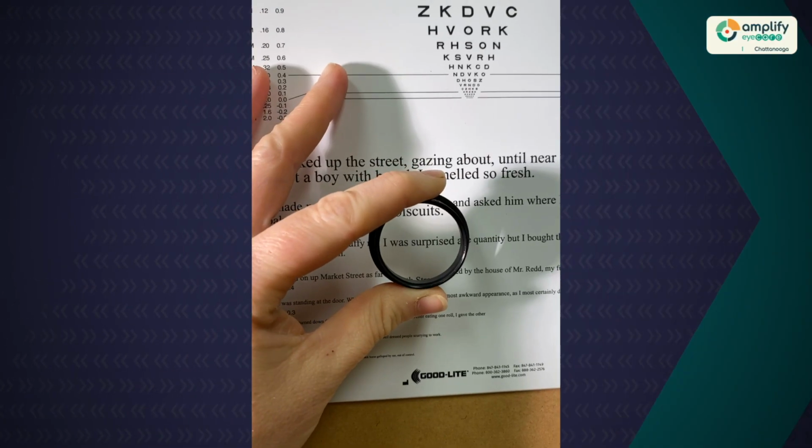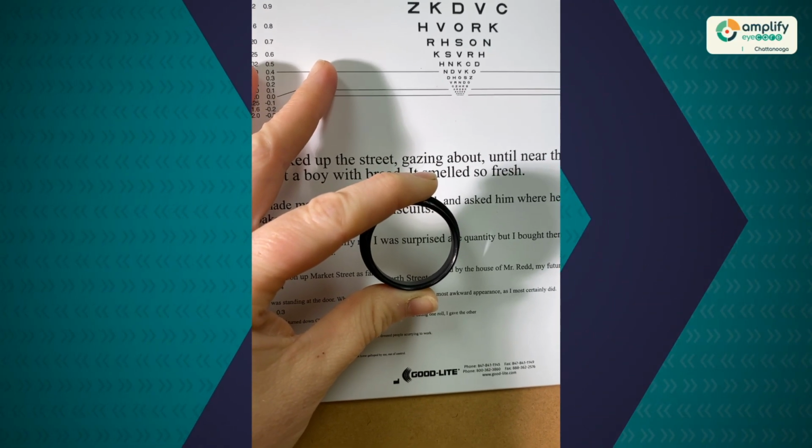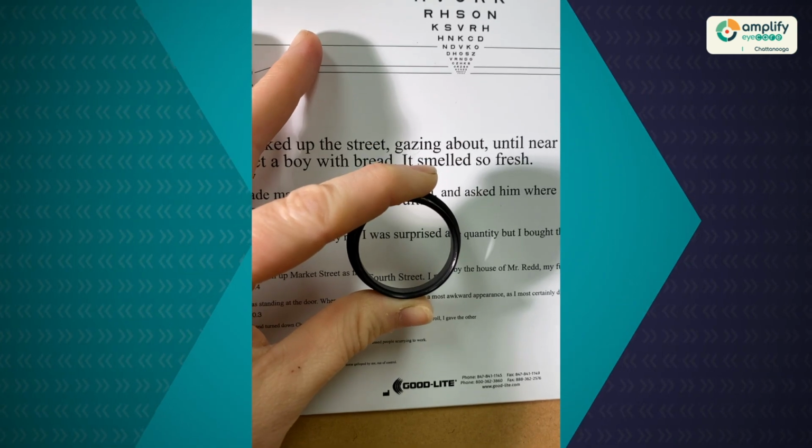So when we get magnification like this, the working distance has to become closer. And when they hold it closer, of course, it strains the eyes because they're having to converge or cross together more. This is an example of a 2x full diameter microscope. So this would help somebody at near.